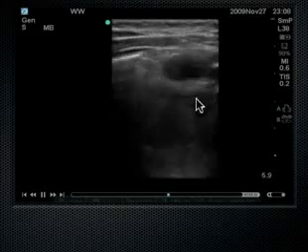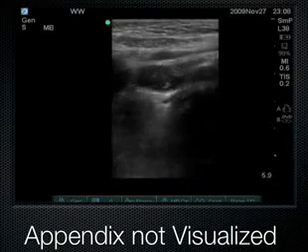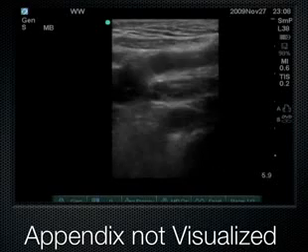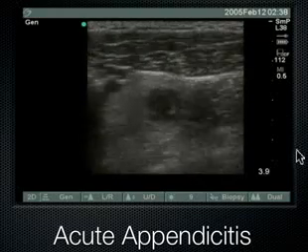We see a lot of peristalsis of bowel, but we don't actually see the appendix here, and that's part of the study. So when you practice on this, this is likely what you're going to see in a normal individual. Just psoas coming all the way up and coming in contact with your abdominal oblique. And this patient here has got acute appendicitis.